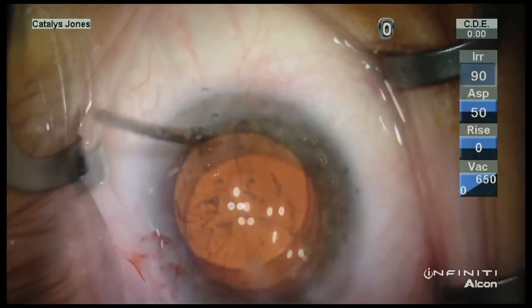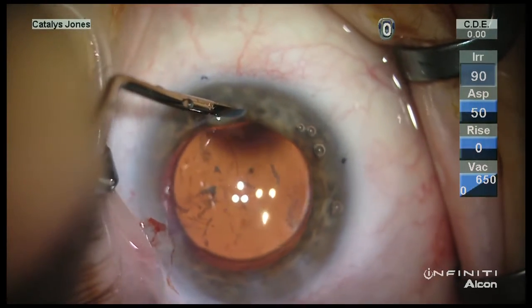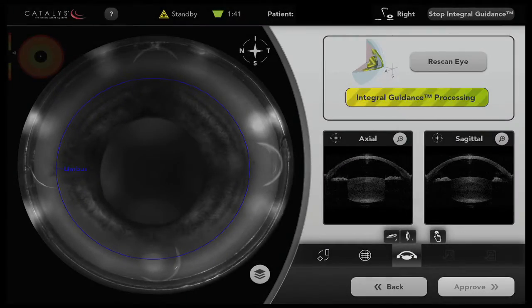Here I've located the incision with a Sinskey, and then I'm going to use here a spatulated dissector to complete the opening at the end of the case.